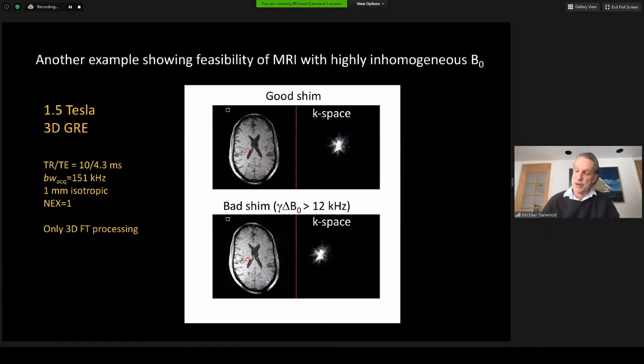As another example, here I show a single slice from a T1-weighted 3D gradient recalled echo acquisition with the 1.5T whole body magnet, having a good shim on the top and a bad shim, giving 12 kilohertz frequency variation over the brain at the bottom. These are the raw images. No post-processing distortion correction has been performed. As you can see, except for a modest degree of distortion due to the inhomogeneity's effect on the frequency encoding, the images are very similar in quality and signal-to-noise ratio using a relatively high acquisition bandwidth and a short echo time, in this case 4.3 milliseconds, made this imaging possible despite extreme field inhomogeneity.